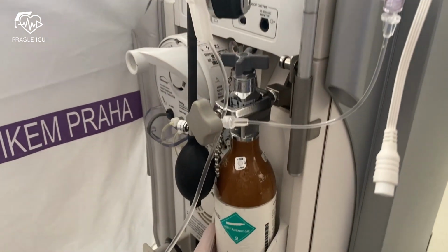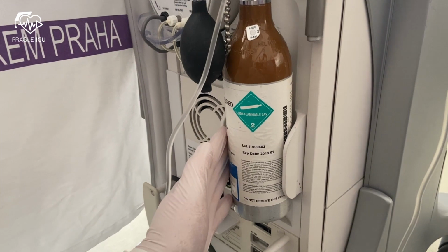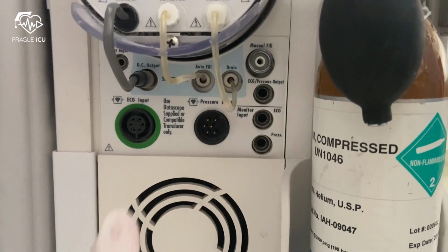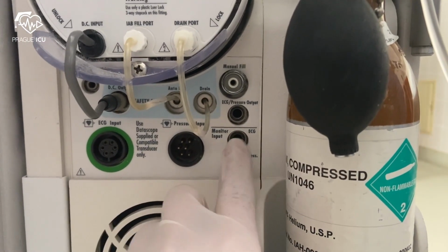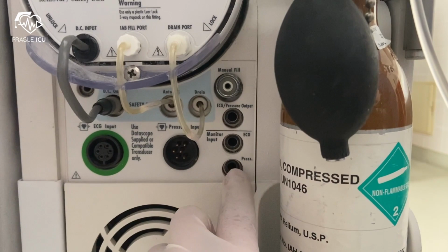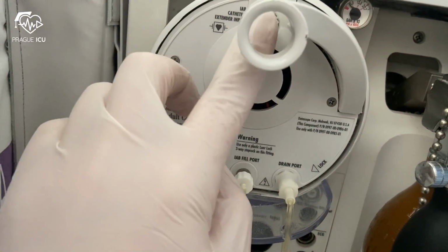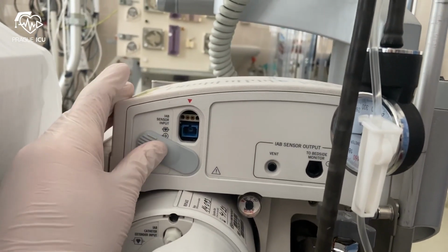First of all, let's get oriented in the CS300 machine. Here is the helium tank. Then there is ECG input, pressure input, and ECG and pressure input from a monitor. Here is balloon pump catheter helium input and balloon fiber optic sensor input.